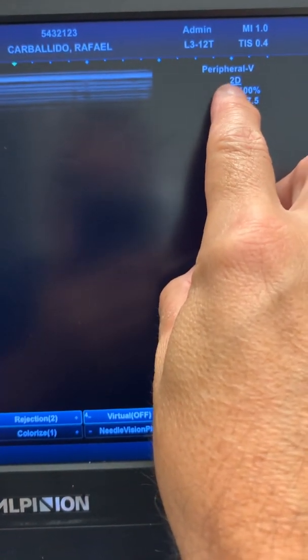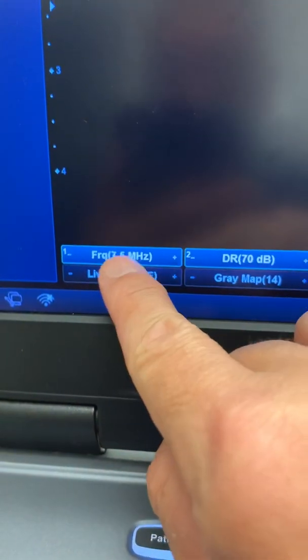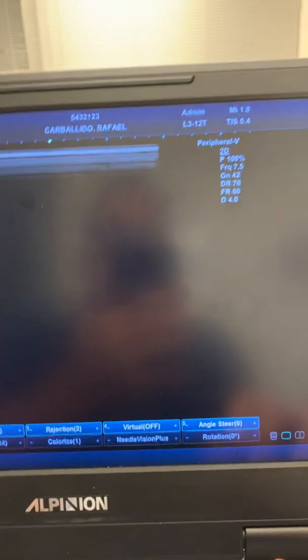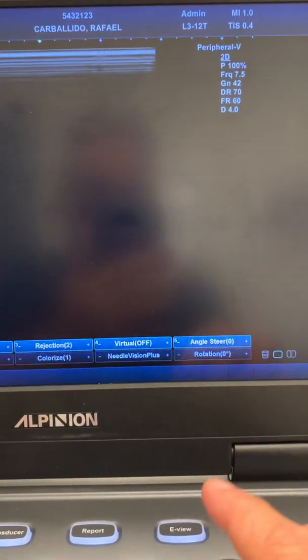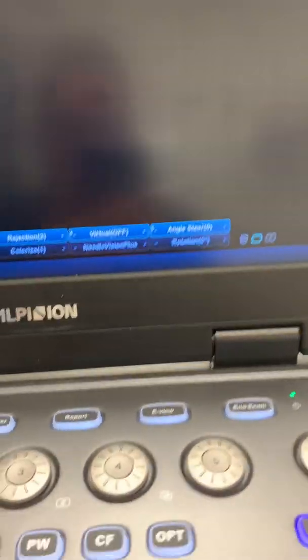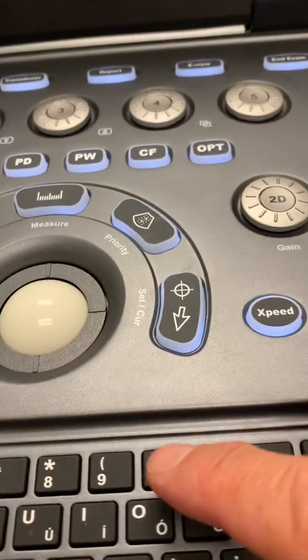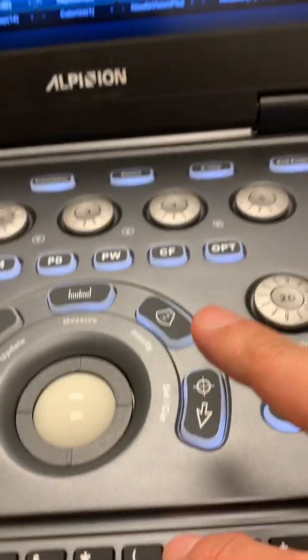This would be 2D, which means fundamental imaging, no harmonic. So the machine is doing now 7.5 megahertz of fundamental image. If I want to use harmonic, I click the key number zero.